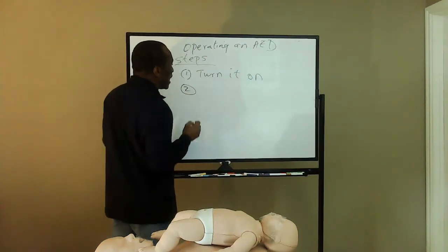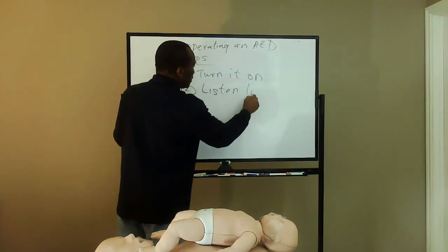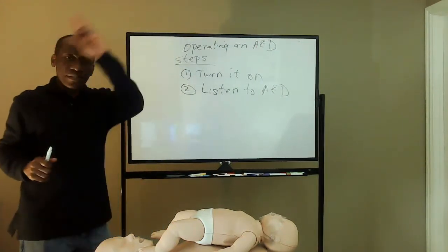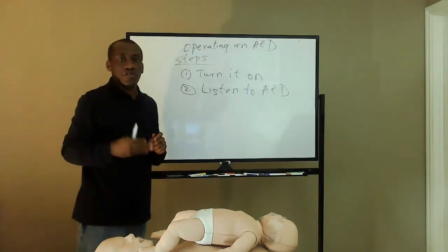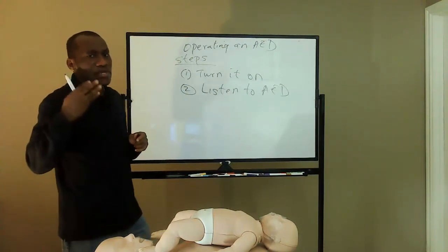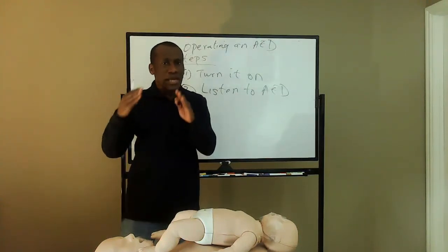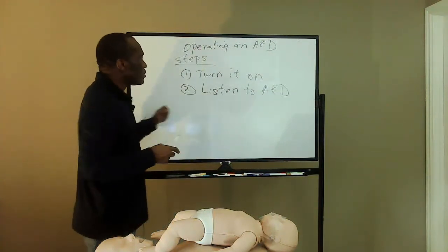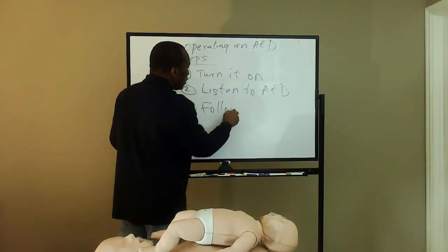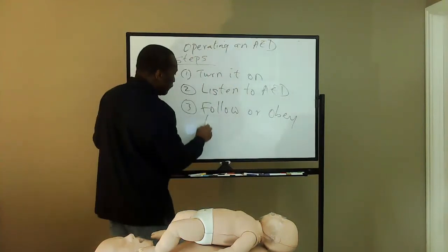As soon as you do that, now you have to listen to the AED's instructions. As soon as it is turned on, it begins to talk to you. Remember, this is computerized. So the AED has some degree of intelligence. It can lead you through the way. So listen to the AED and follow or obey the voice prompts.